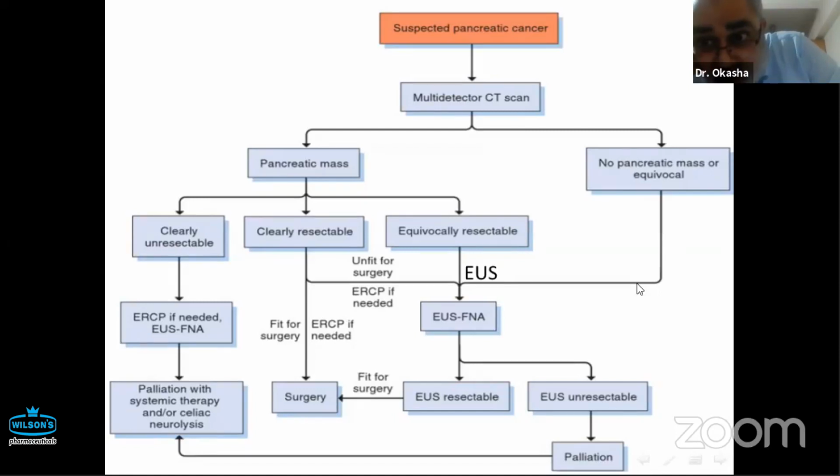Sometimes I found, after 6 cycles of chemotherapy and after 6 months, I see a minimal decrease in the size of the mass compared to 6 months before, but the PET scan says there is no activity. Now the tumor is dead, but still there. So it is very important to combine EUS and PET scan in cases of neoadjuvant chemotherapy for downstaging for possible radical surgery later on.